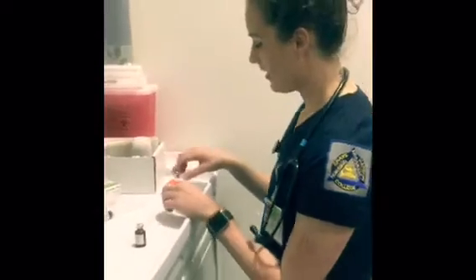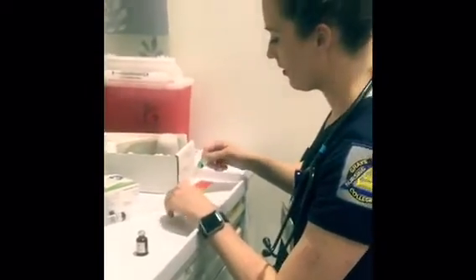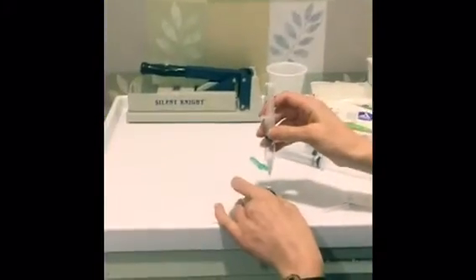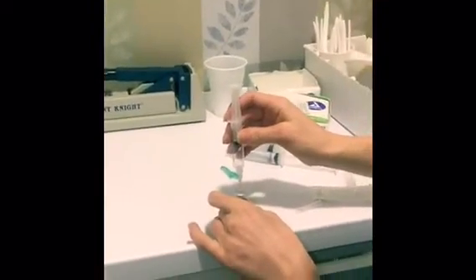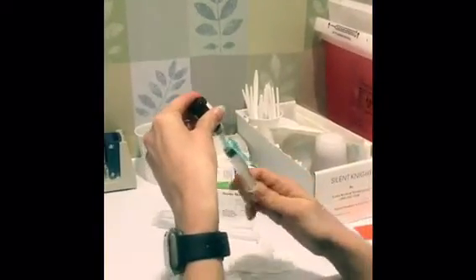So to get started, I'm going to take my syringe and open up a needle, attach it to there. Okay, so I'm going to draw up some air. I'm going to draw it up to 4 and inject that into my vial that hasn't been used before, or else I would wipe it off with an alcohol swab.